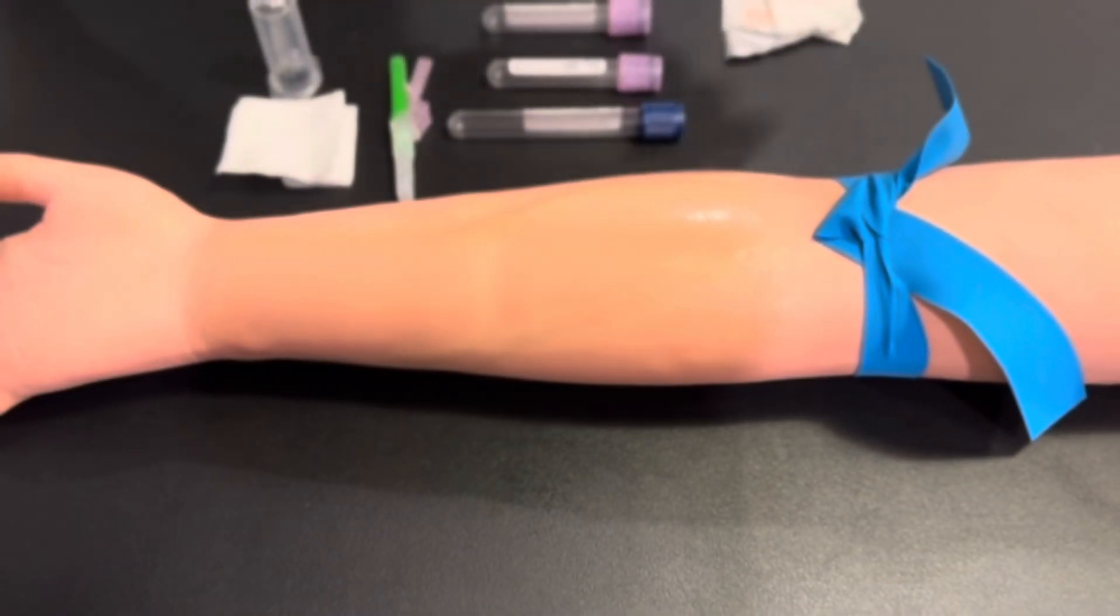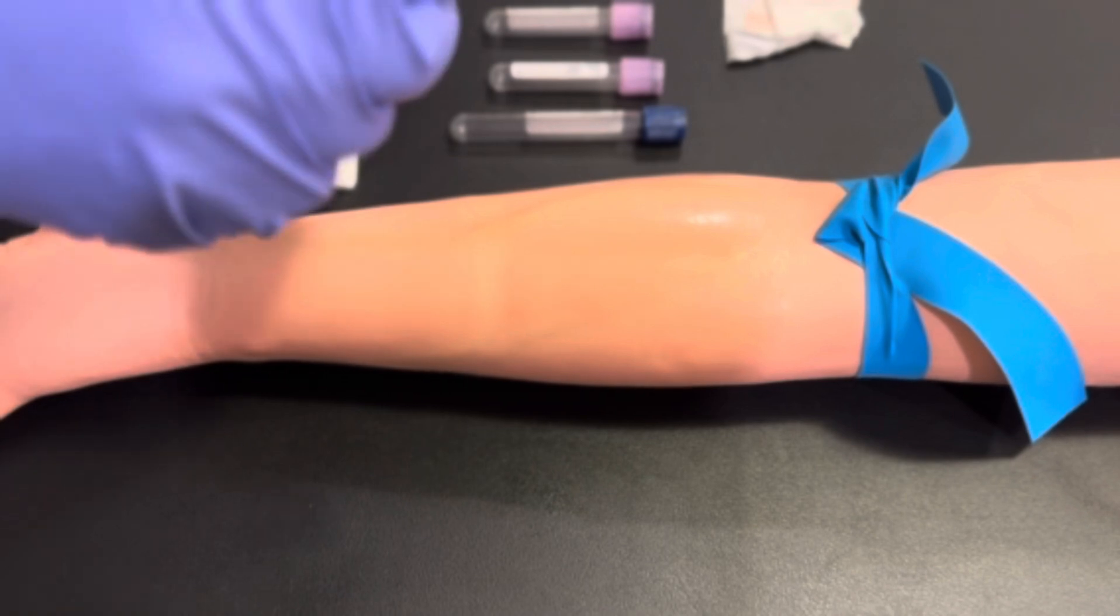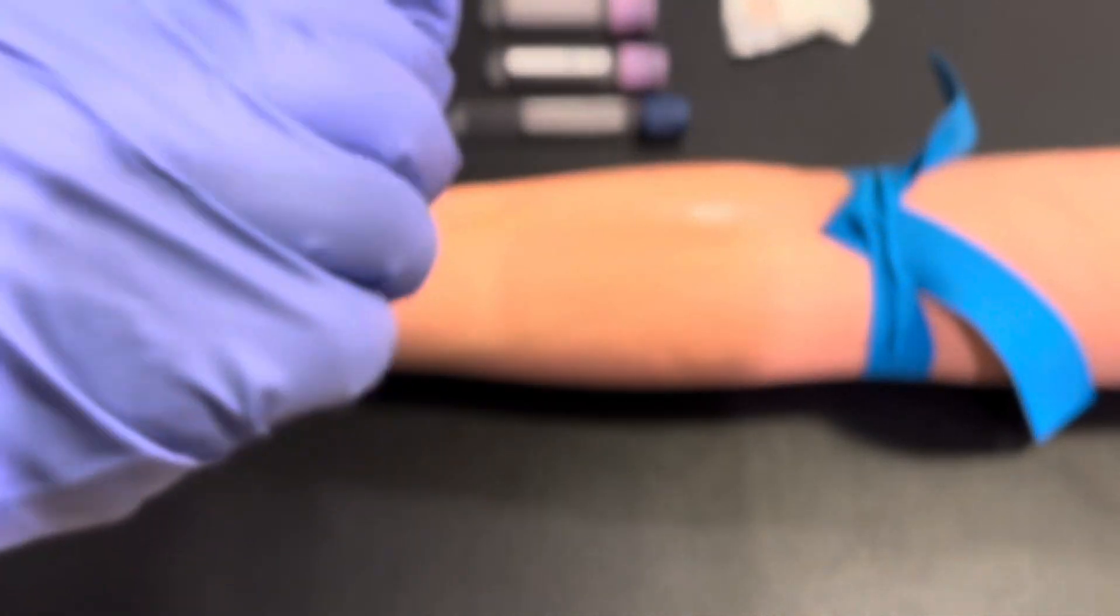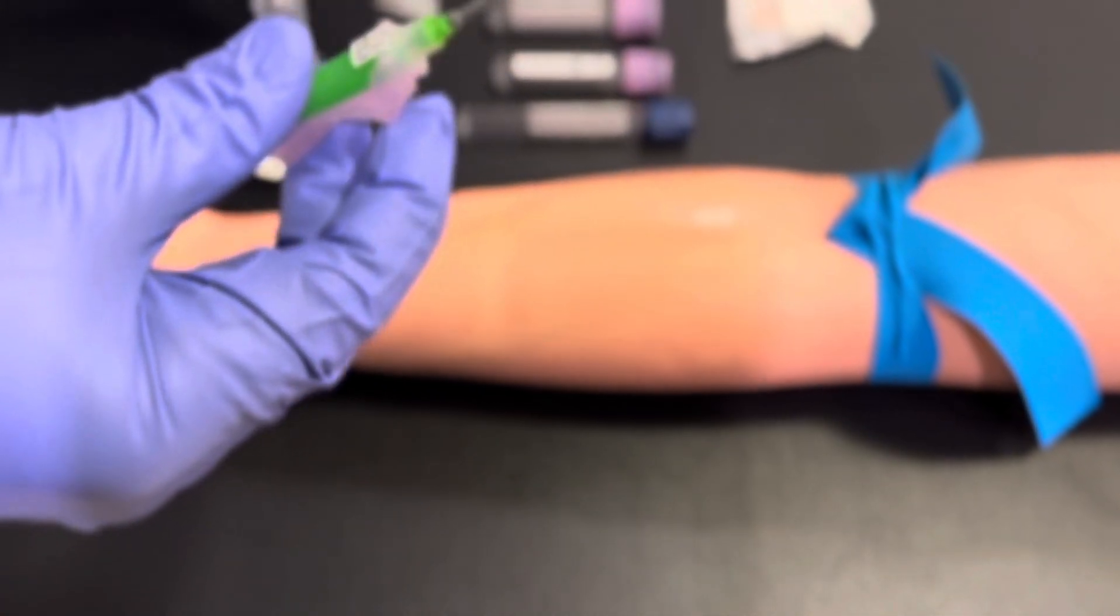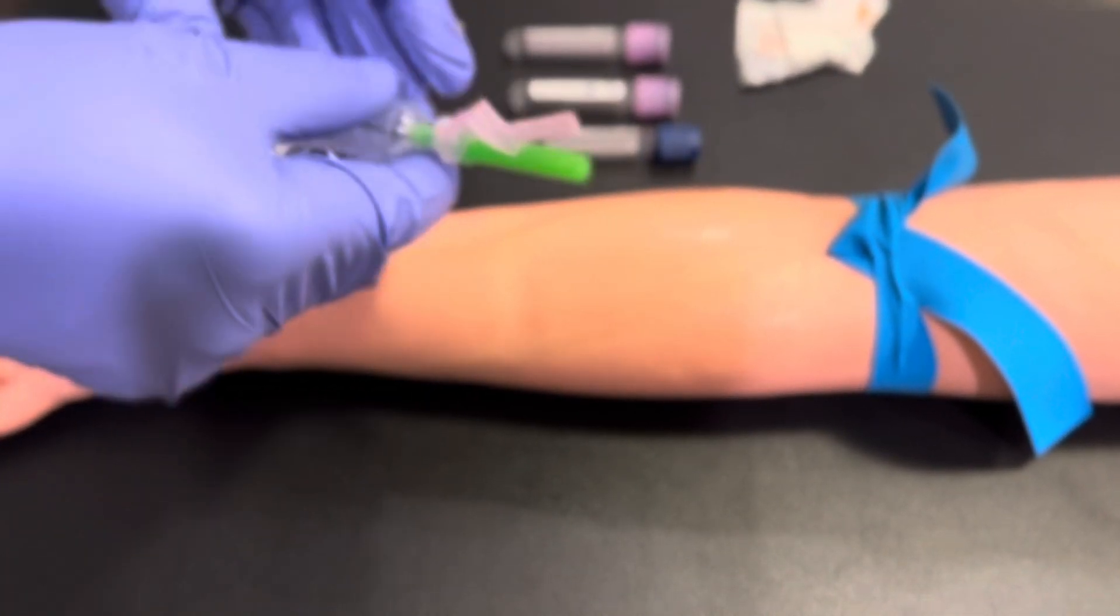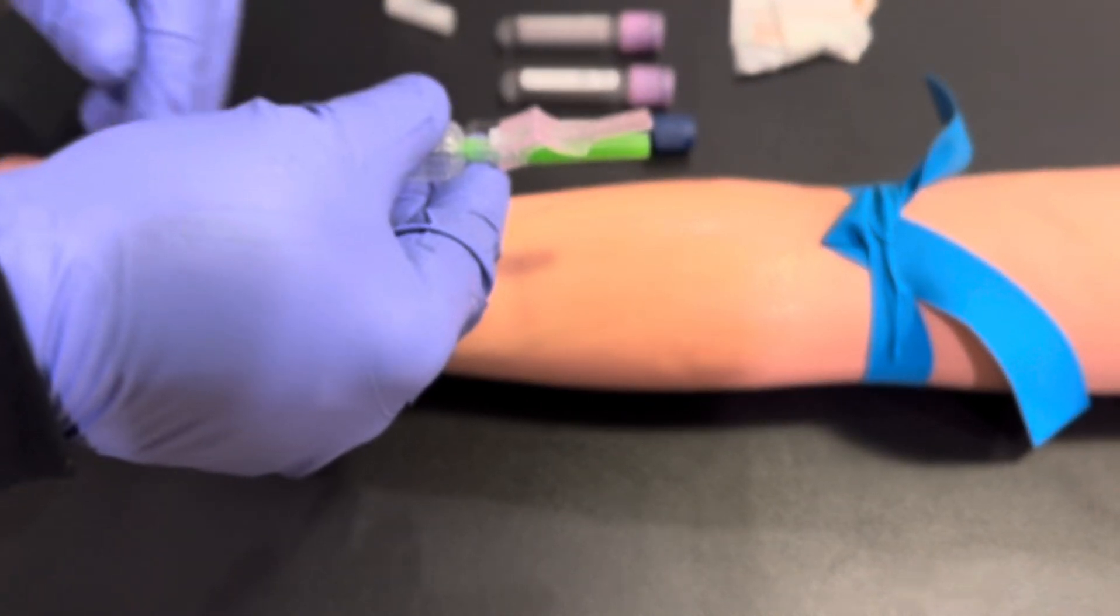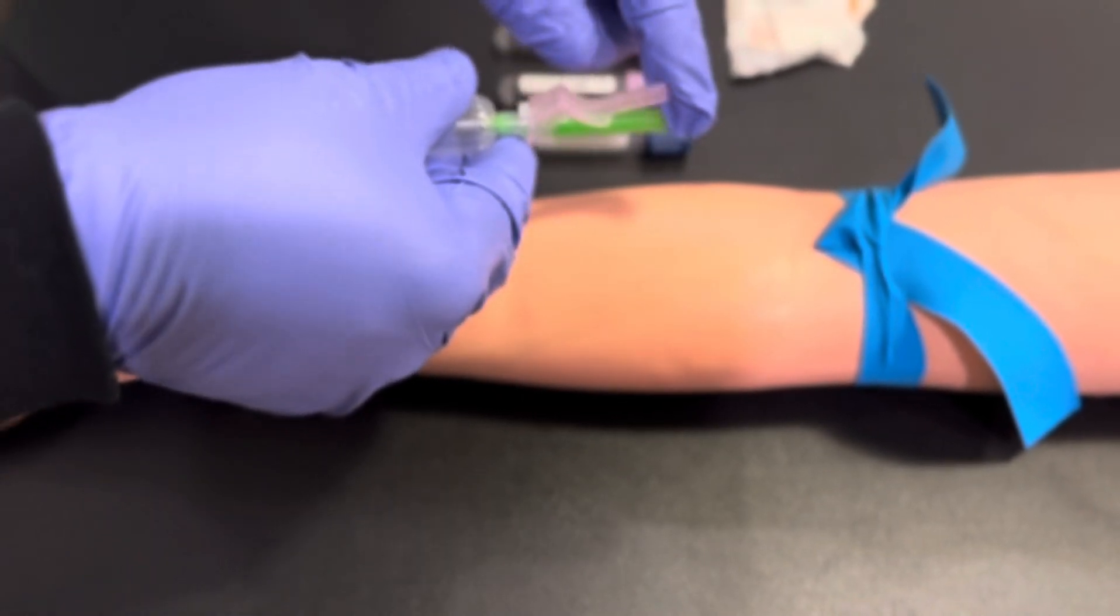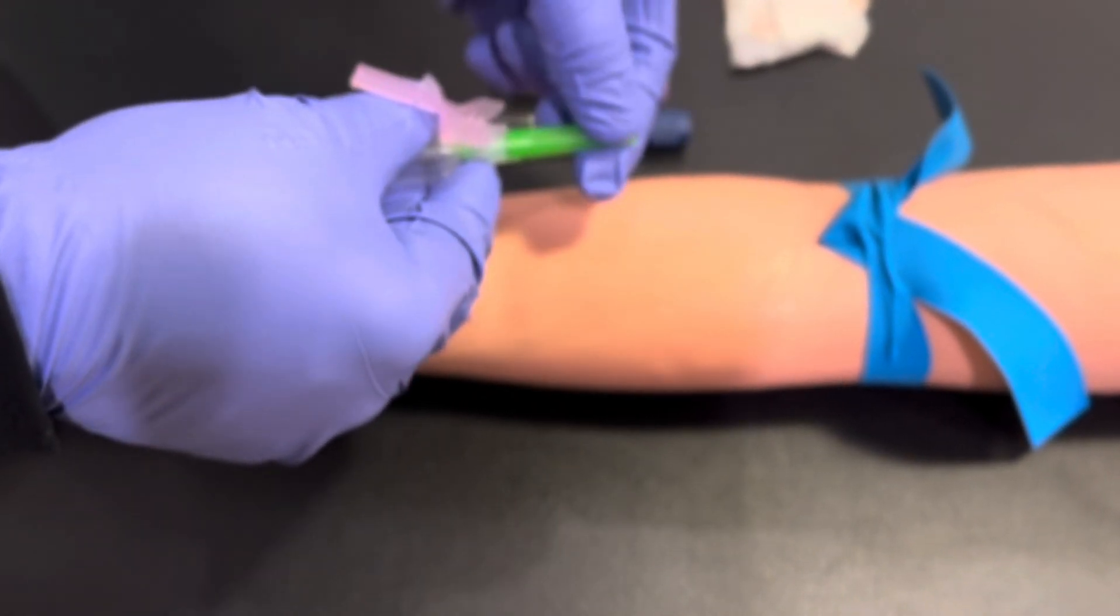Once the site has dried, please assemble your vacutainer straight needle into the vacutainer holder. Utilize the proper hand-holding guidelines to ensure that the needle is secure and stable.